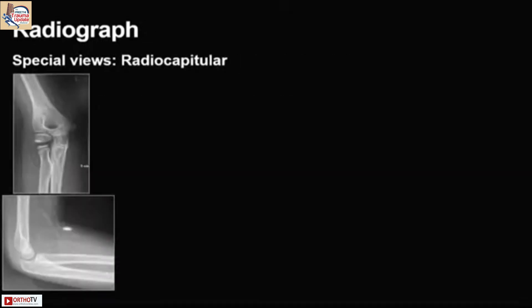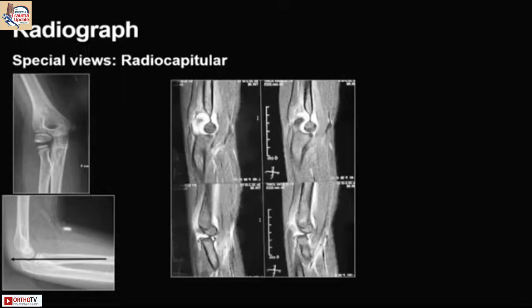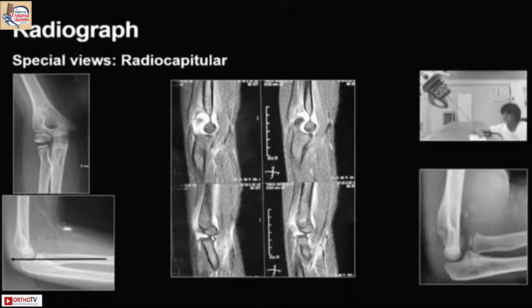In very special situations, we may need a view called the radiocapitular view. Here is an example: the radial head of this child is slightly posteriorly subluxed. To determine whether it's eccentric ossification or something else, we took an MRI and noted there was a radial head fracture causing the posterior subluxation. That view may throw better light on such things.